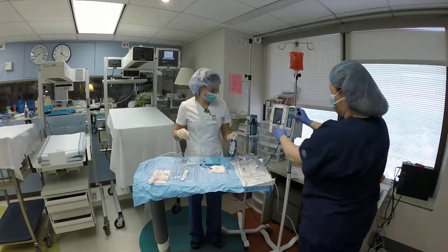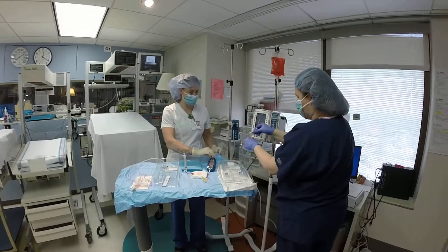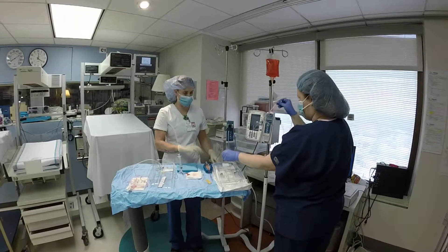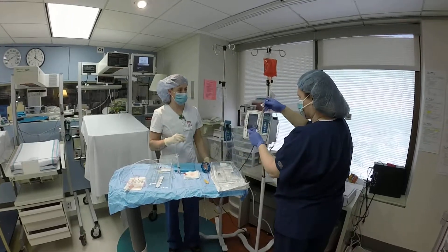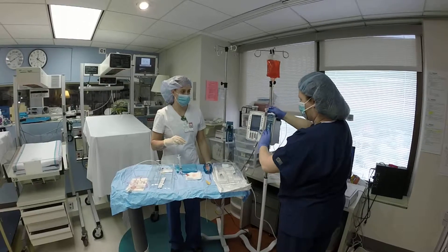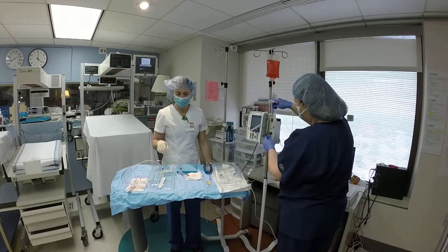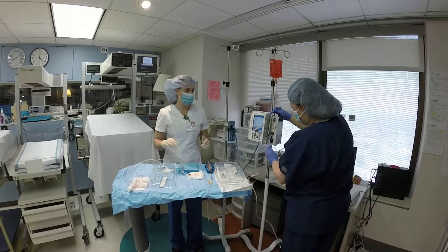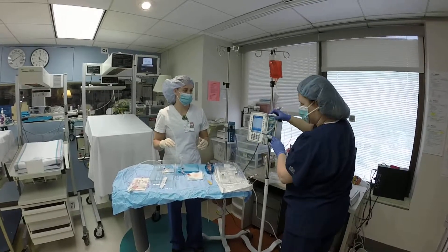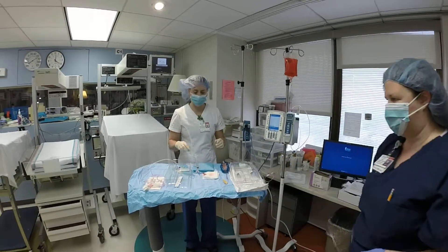Put your blood tubing in the pump, and you'll want to set your pump to a volume over time for the aliquots that are going to be pulled. So that at the end of the time, it will beep off, and then they can discard and pull off the next aliquot.